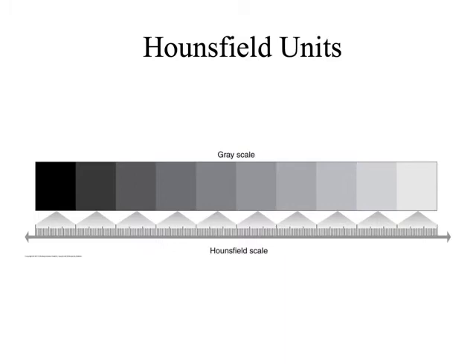Hounsfield units are going to be a way of capturing the attenuation. And when we talk about the attenuation of the X-ray beam, we're talking about the degree to which the X-ray beam is reduced by an object. And so it might be reduced by photoelectric effect.